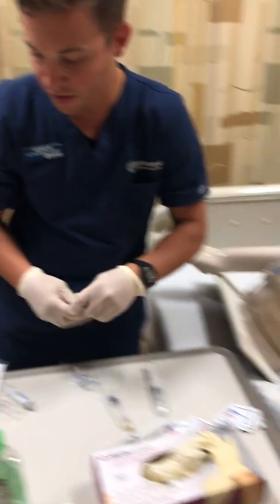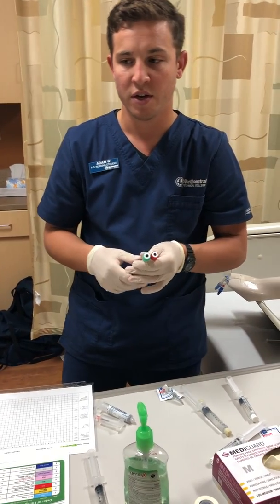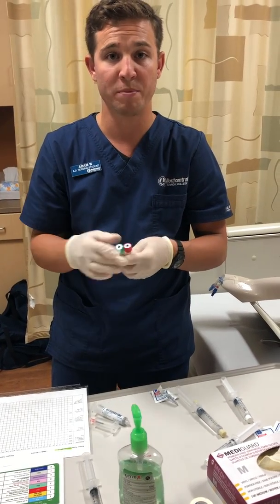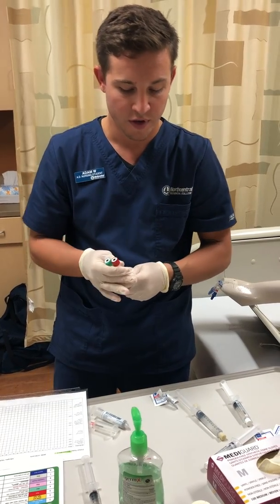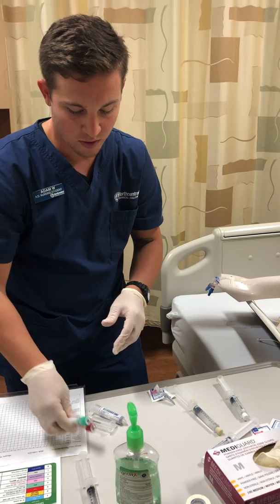Very good. So these are going to go inside a biohazard bag, and I'll also be attaching the requisition form that goes with it. Make sure that the form is filled out with what we need. Okay, so we're going to set that aside.